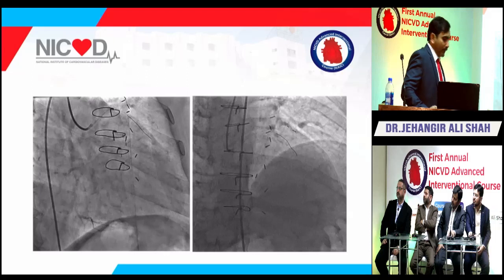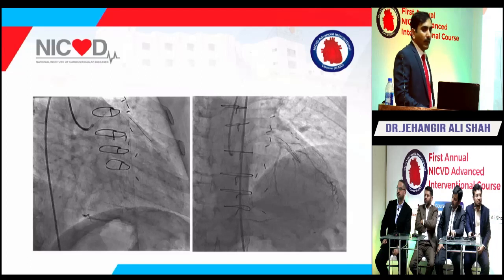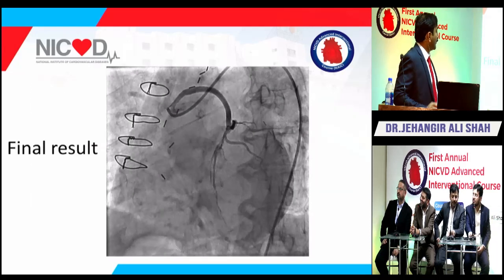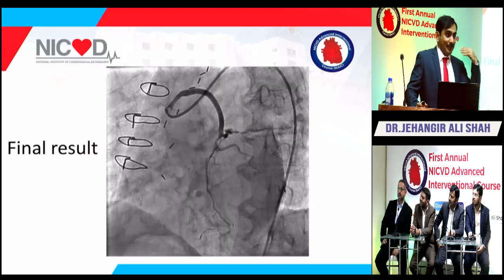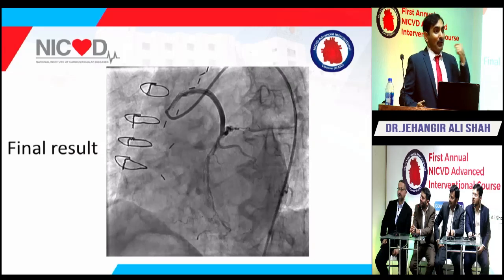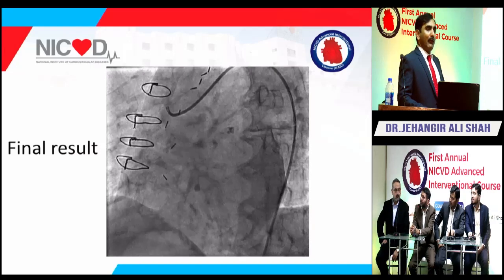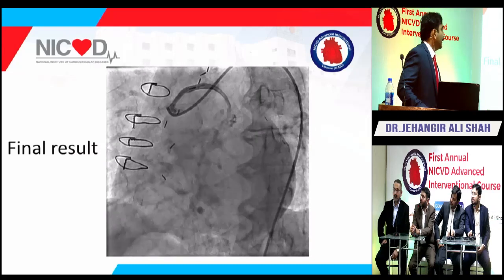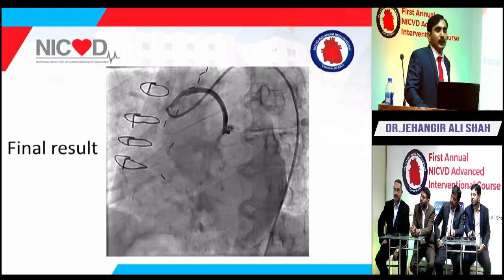And this was the result after. You know the other longitudinal deformity, already discussed. You can see while you are trying to engage the guider, you will lead to this complication. Yeah, so avoid engagement of the guider after putting a stent, because you may face these complications. Just right with the balloon, you are taking this. Yeah, you can do this.